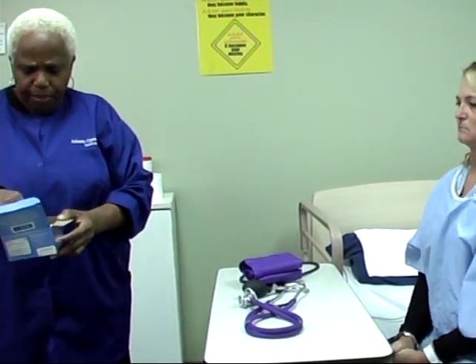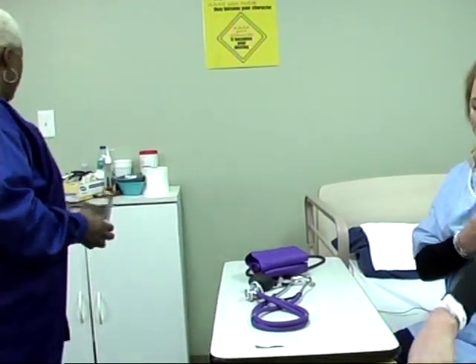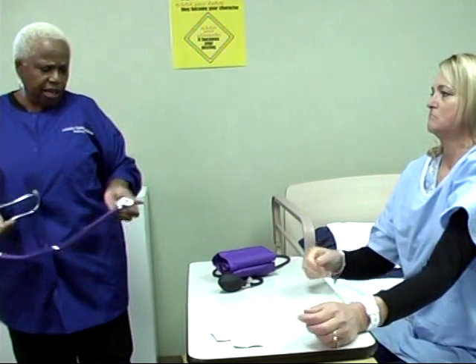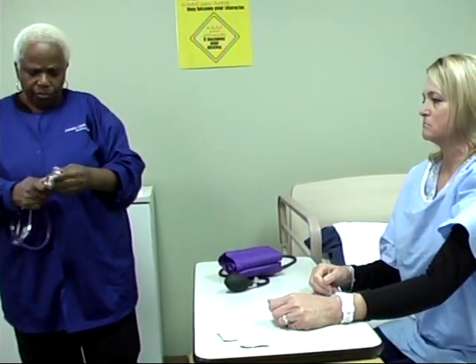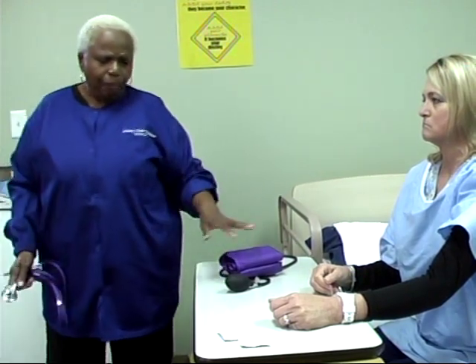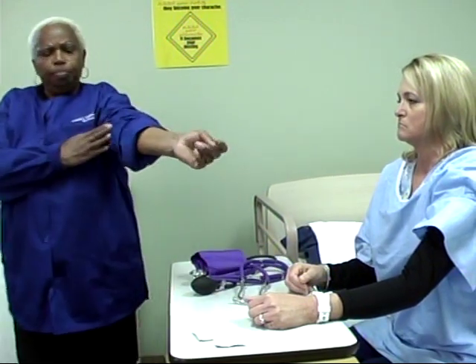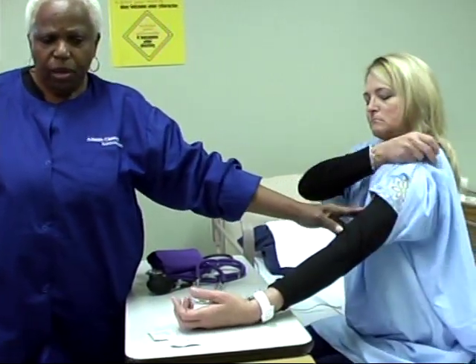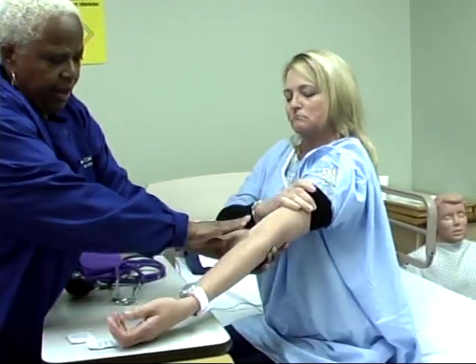Reading the blood pressures is something that we're going to have to do in the classroom. You need to know how to do the blood pressures and understand what each one of these are and how we use them. First, we have to realize that we get the blood pressure at the brachial pulse, which is the one between your elbow and your shoulder.